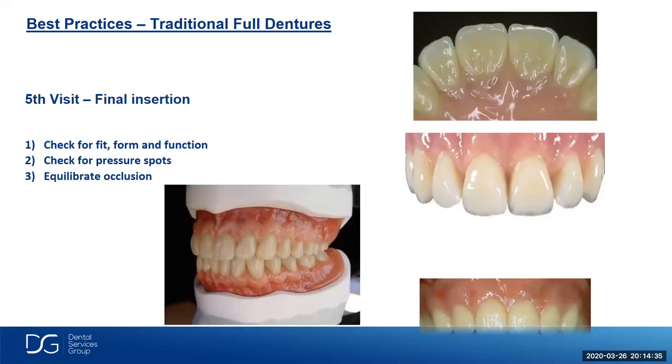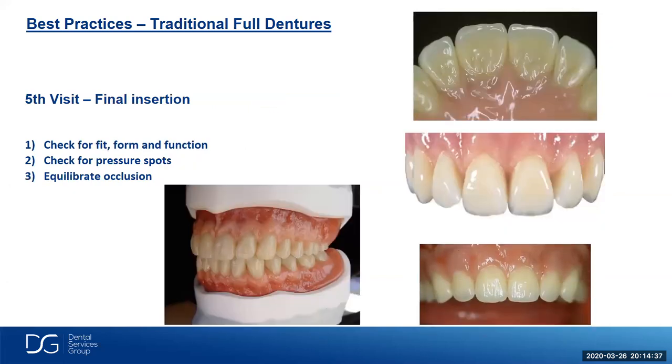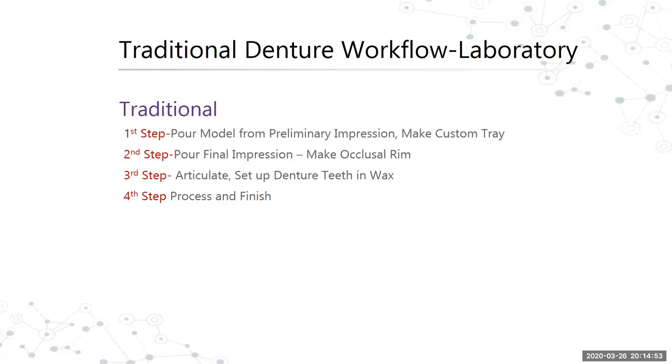And the fifth visit is your final insertion, so the check for fit, form, and function, your check for pressure spots, equilibrate the occlusion, and then you're all set. But many times this takes a little bit of time, if it's not made correctly and the information wasn't there from the beginning and we're not using the correct techniques.